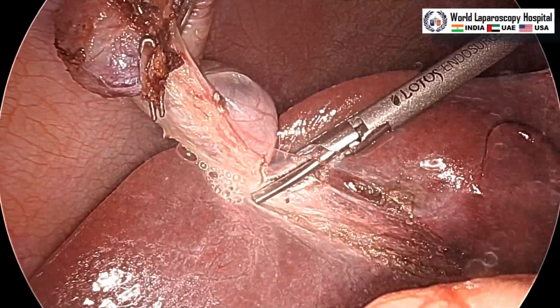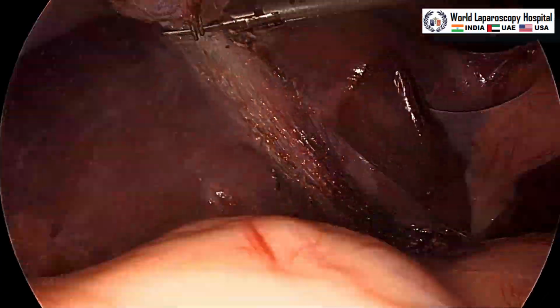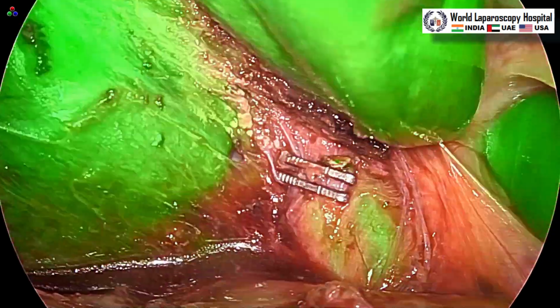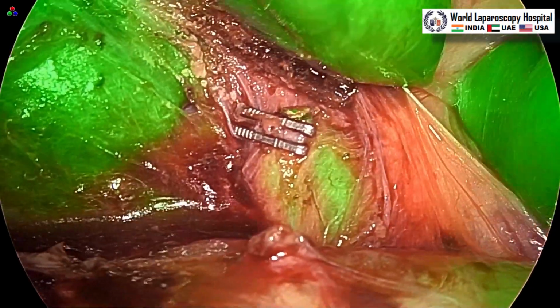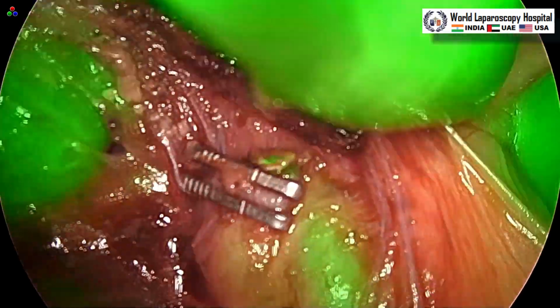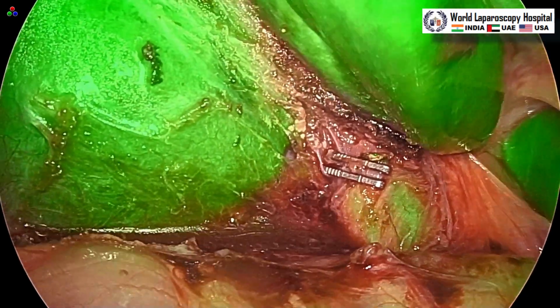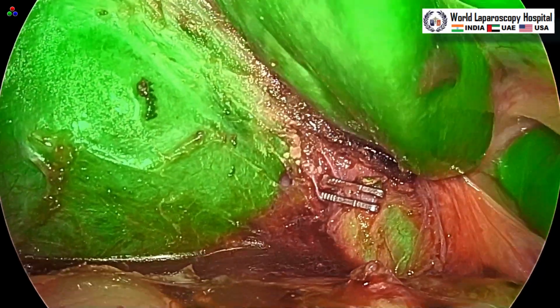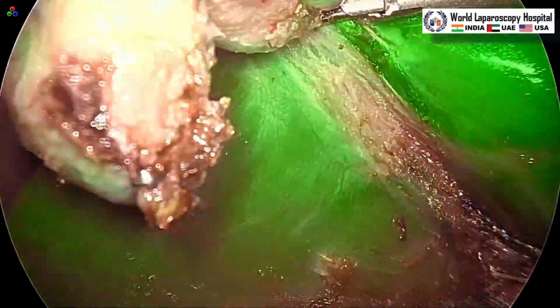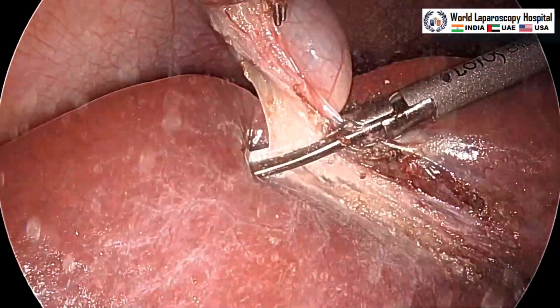Now it is almost over, but before cutting the last part, we will have a final view, and the light cable is kept at the 12 o'clock position, and again ICG mode is done. You can see the cystic duct is clipped and the CBD is nicely visible. There is no duct of Luschka or cystohepatic duct, and there is no bleeding, and it is dry. After that, you can switch off the ICG mode, and then the final cut will be given to separate the gallbladder from the liver.